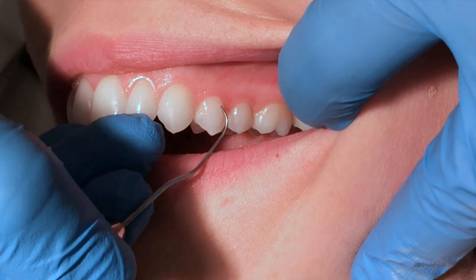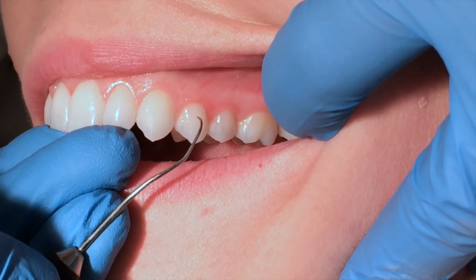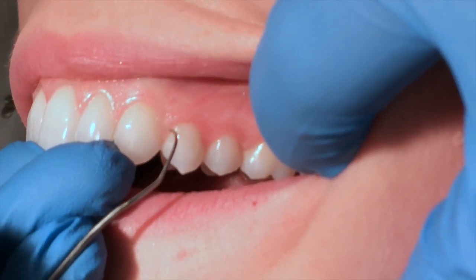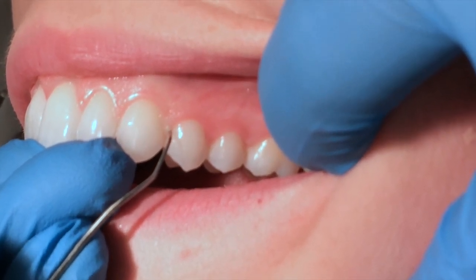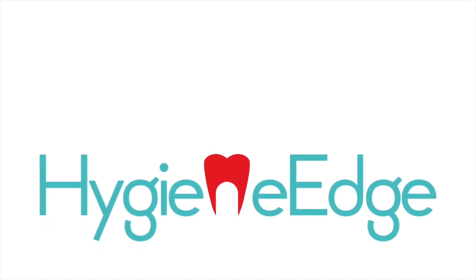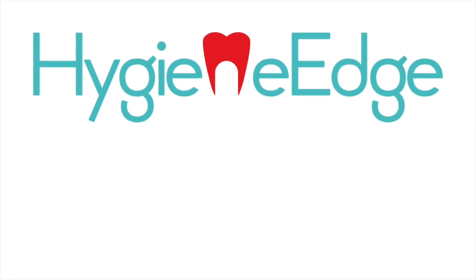Relax my grasp. Pull out. Come across the facial. And I'm rolling, rolling, rolling. A lot of times clinicians aren't adapting enough — that is quite a generous roll to get across that line angle. All the way down. Watch how far I extend interproximal to make sure I'm getting underneath that contact and up. All the way back. Take a look.